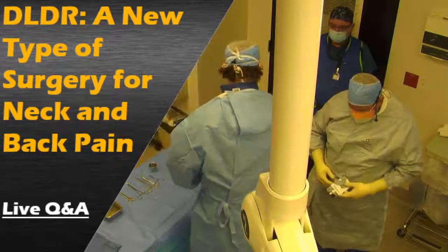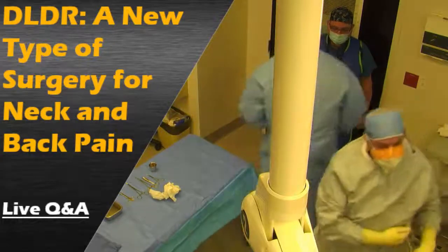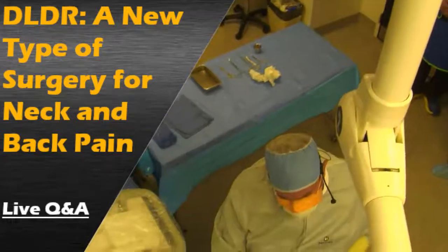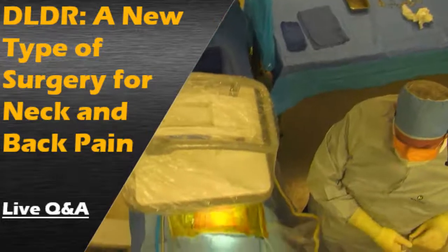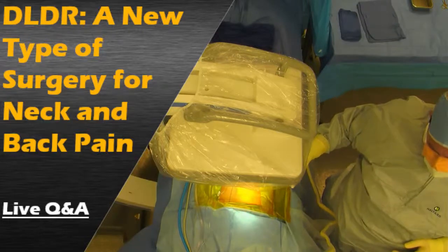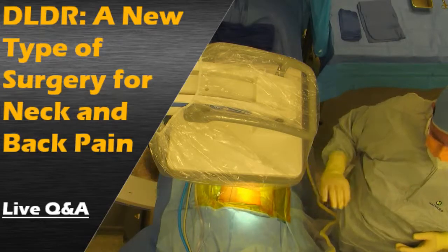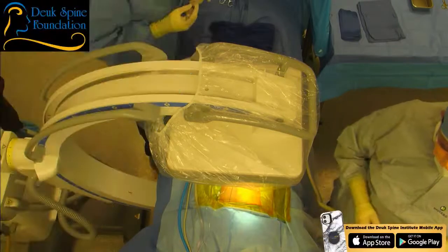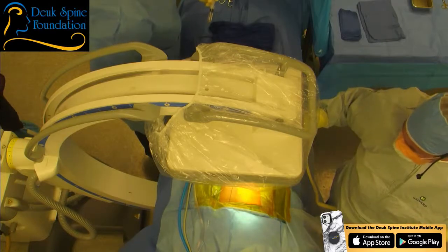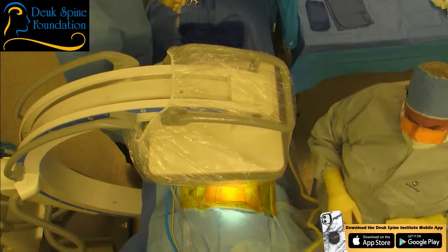At L4-5, left approach. So, I usually do a little bit of local to numb up the skin, and then when I start passing the dilator — I'll tell you when — but when I get down to the annulus of the disc, it's going to be uncomfortable. That's when we need the most control. The procedure should take about 15 to 20 minutes max.